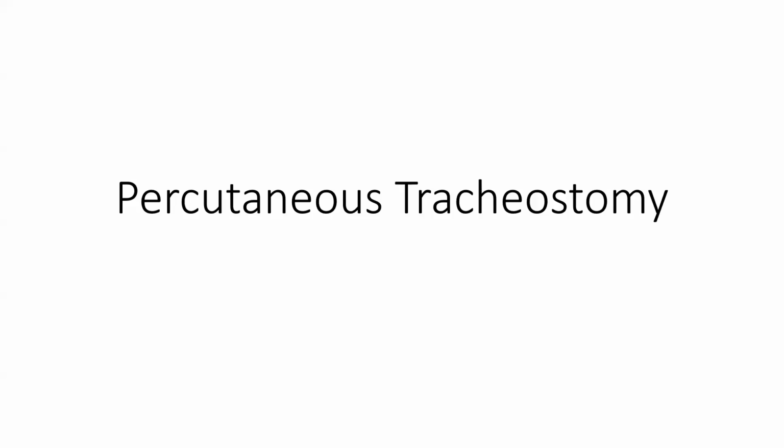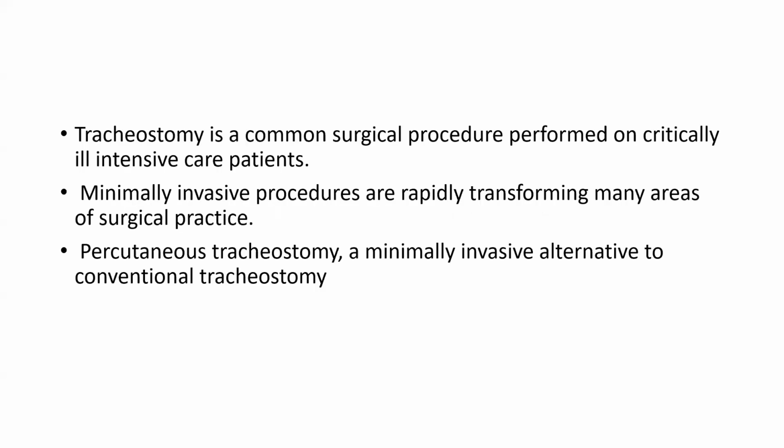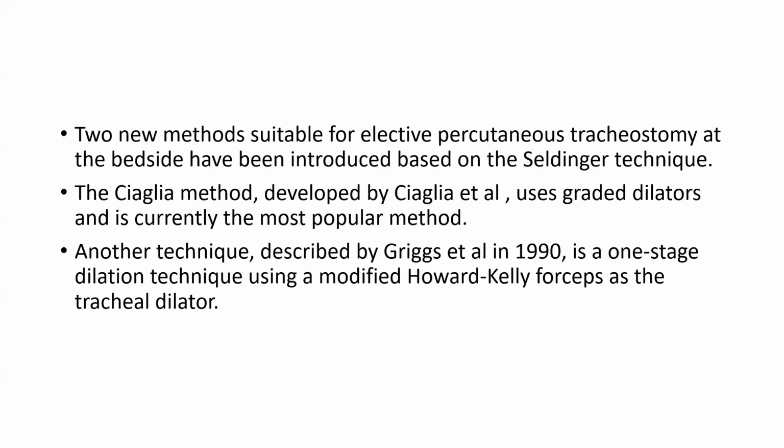Hello everybody. Today we are discussing percutaneous tracheostomy. Tracheostomy is a common surgical procedure performed on the critically ill intensive care patient. Minimally invasive procedures are rapidly transforming many areas of surgical practice. Percutaneous tracheostomy is the minimally invasive alternative to the conventional tracheostomy.